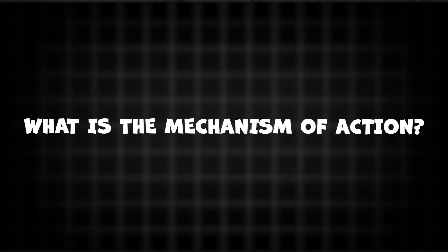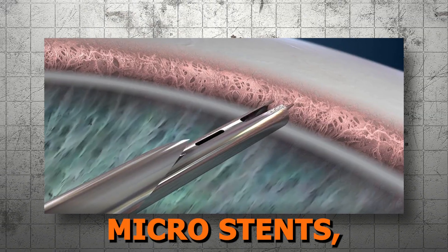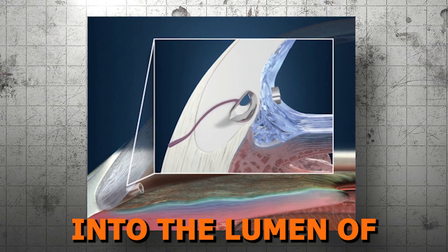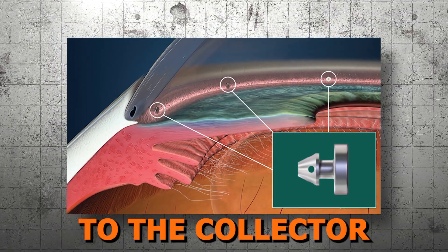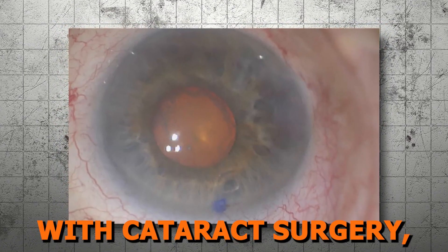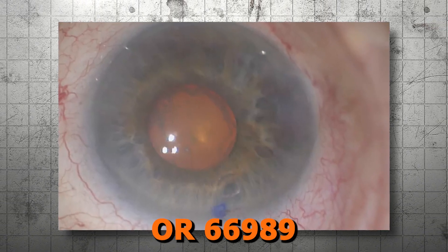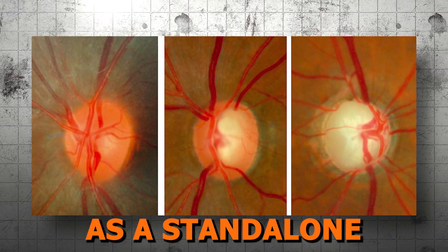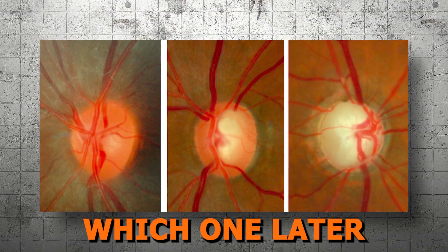With these micro stents, you pierce through the trabecular meshwork and insert the metallic device that seats directly into the lumen of Schlemm's canal and allows for direct flow of aqueous humor from the anterior chamber to the collector channels. Until recently, these procedures could only be done in conjunction with cataract surgery with CPT codes 66991 or 66989 when the cataract is complicated. But now, there is a micro stent that can be done as a standalone procedure in mild, moderate, or severe refractory open-angle glaucoma, and we'll share which one later in this video.